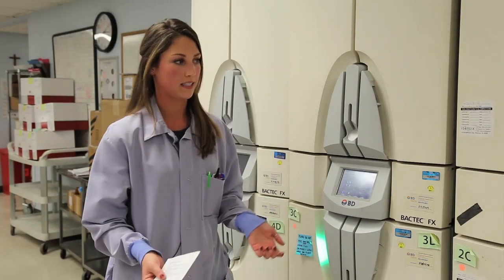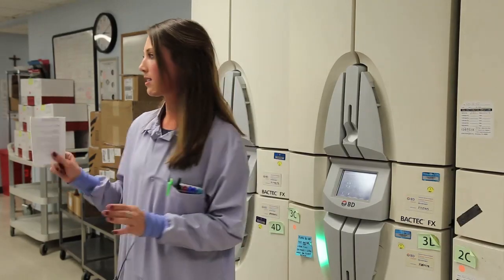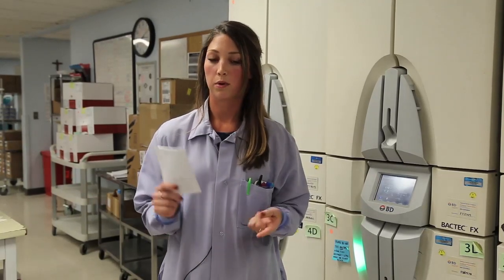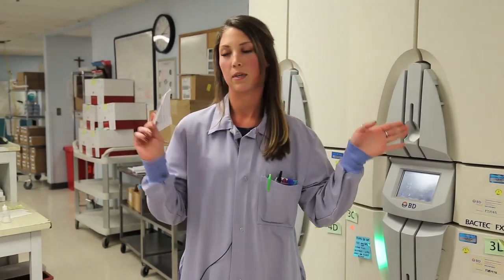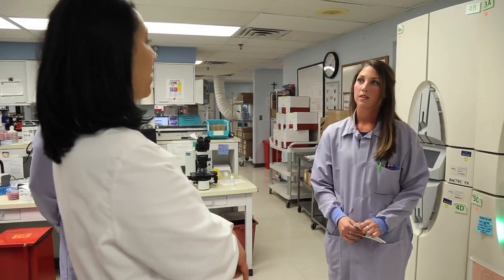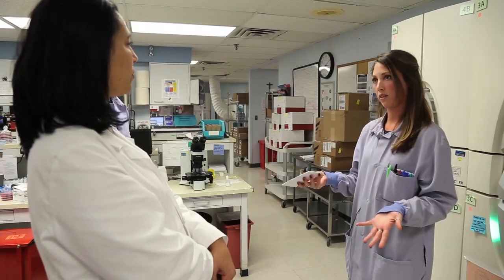As soon as it goes positive, we have 2 hours, similar to the 2-hour turnaround time up there, to make a gram stain and then decide what type of PCR it will get. And then after that, we have to call it up to the floor as a critical report. So we will be giving the doctor or the floor the gram stain result as well as a correlating PCR result. Okay. So it pops up positive. You don't notify the doctor until you've gotten the PCR report. Yes. So the gram stain is 100% necessary. We won't just tell them that it was positive. We need to give them some sort of information.